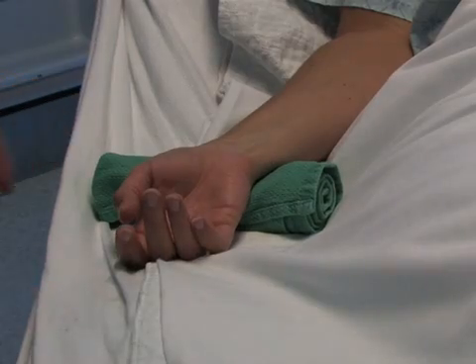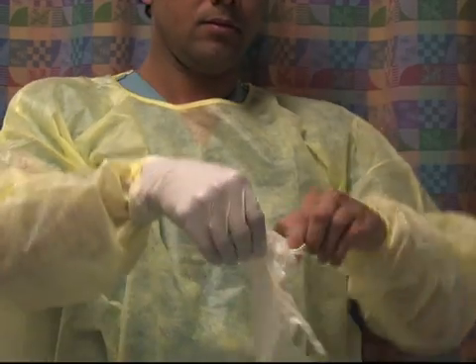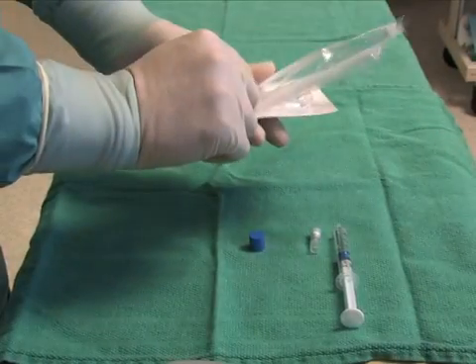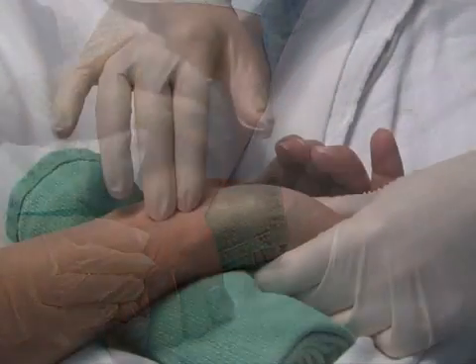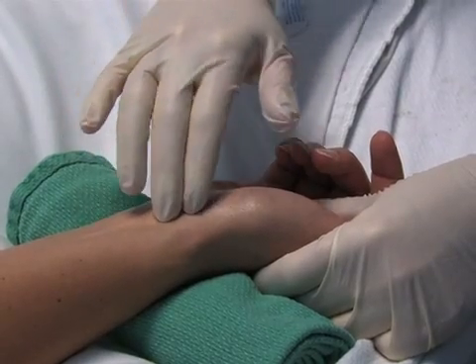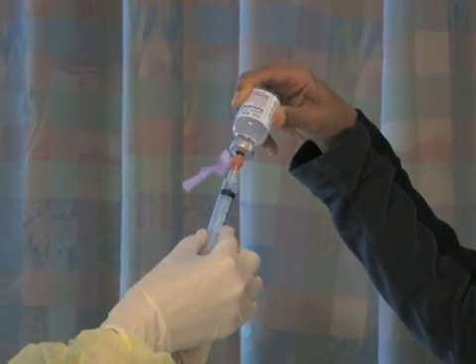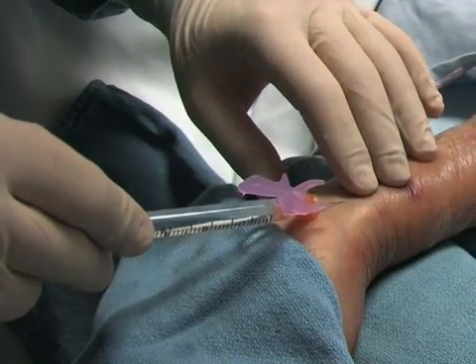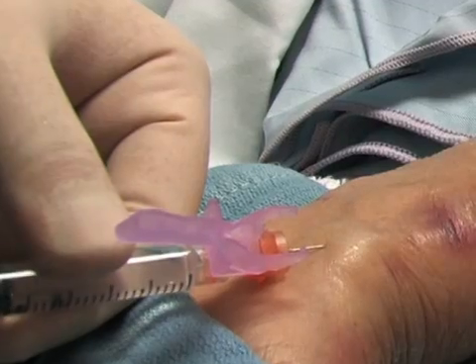A portable Doppler ultrasound device may be used to identify the location of the radial artery in these instances. Extend the patient's wrist and place a rolled towel under it to maintain it in an extended position. Once positioned, put on a non-sterile gown and gloves. Open the arterial blood gas kit and identify all components. Clean the site with an alcohol swab. Palpate the radial pulse to determine the point of maximum impulse, or use the Doppler ultrasound device to identify the artery. Using the 5cc syringe and small needle, draw up 1% lidocaine. Upon introducing the needle under the skin, draw back on the plunger to ensure you have not punctured a vessel. Inject a small wheal of analgesic around the artery and wait 30 to 60 seconds for the lidocaine to take effect.